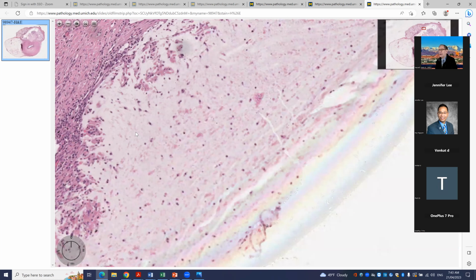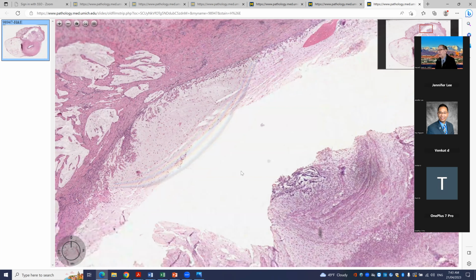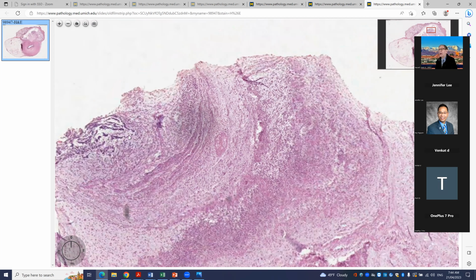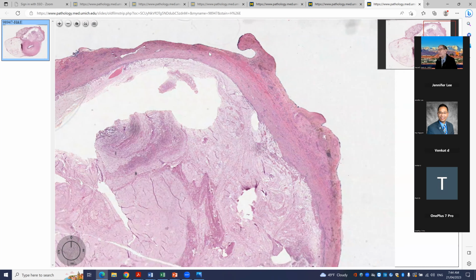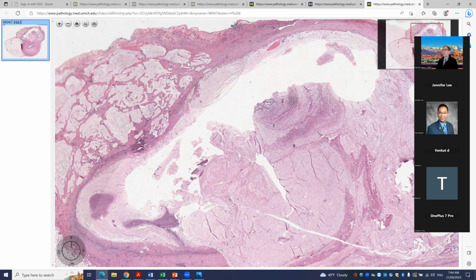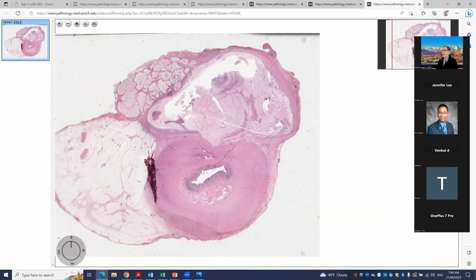So we're not seeing epithelium here in this large space, which is very inflammatory, or in those smaller infiltrative spaces. And so the question here would be, is this peritoneal mucinosis from another source? That's possible. But in the setting where your epithelium is abnormal in the appendix, I think we would be obligated to first rule that out in the appendix.